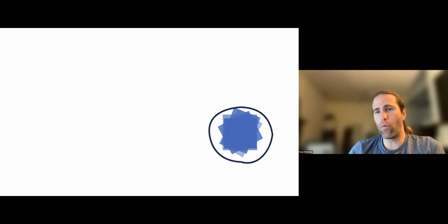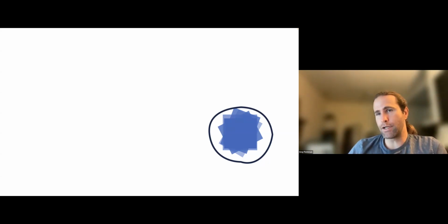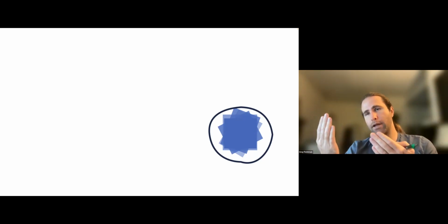And who's to say that that one individual subject is really a good representation of the average anatomy across the population for all of the subjects? The second limitation is that registration is imperfect. And so each one of these alignments has some residual mismatch where you have your initially chosen target and you have a subject registered to it.